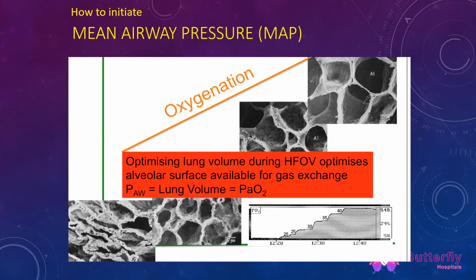So the general tendency is, once you cross pressures of more than 22 in a preterm baby or more than 25 in a term baby, if the baby is needing that much pressure, that's the best case scenario where you want to consider high frequency ventilation, because it will help in both ways. One, it increases the respiratory support that you can provide, at the same time minimizing the trauma to the lungs.